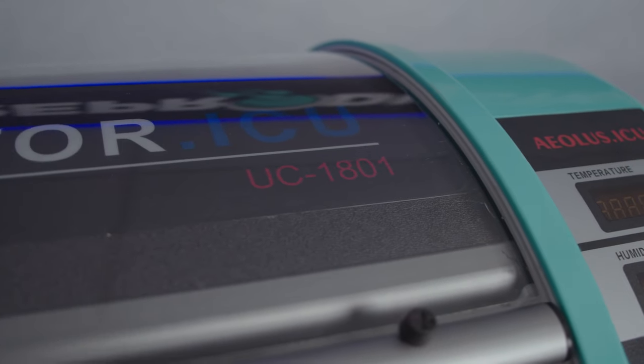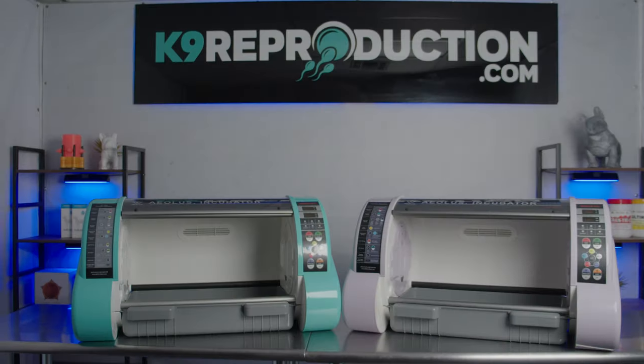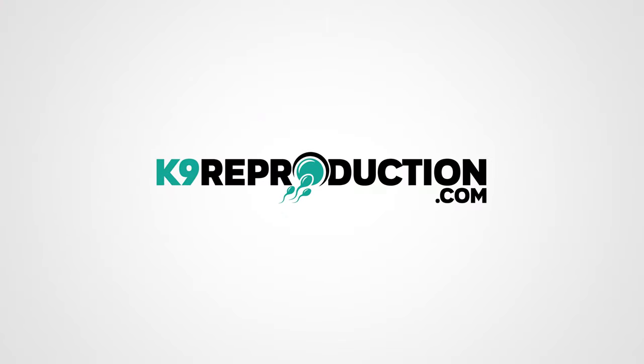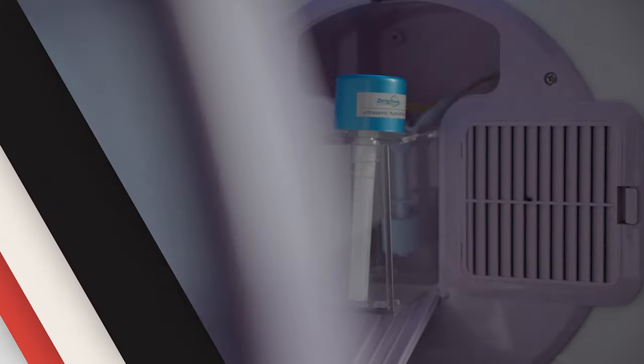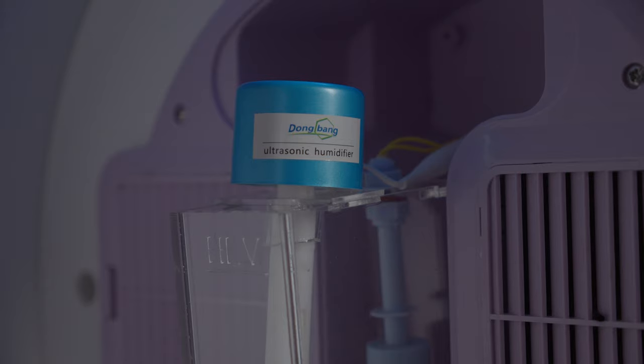Hey guys, this is Travis with CanineReproduction.com, and today we're going to take a look at the Aeolus Model 1801 and the Aeolus Model 1803 Puppy Intensive Care Unit. Included in both the Model 1801 and 1803 is a built-in ultrasonic humidifier.